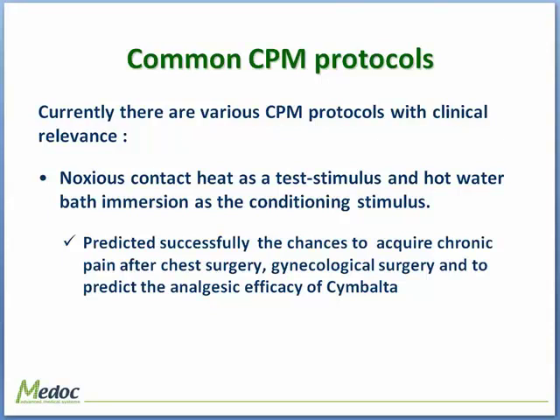We know from other studies that even if it's not a noxious stimulus, usually if it is applied on a large body area, it can also evoke some kind of analgesic response. But by definition, when you're talking about CPM, that is the nociceptive-based response, we're talking about two noxious stimuli. And right now, nobody can tell what combination between test stimulus A, let's say, and conditioning stimulus B, be it hand immersion or another thermode placed, is more efficient, more classical, or more clinically validated. We are not there yet. But I can tell you which protocols are most popular or have more clinical application.